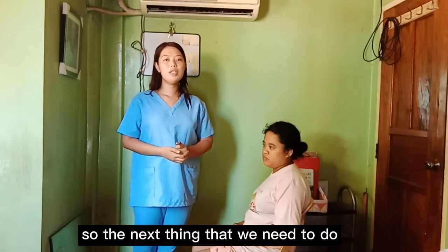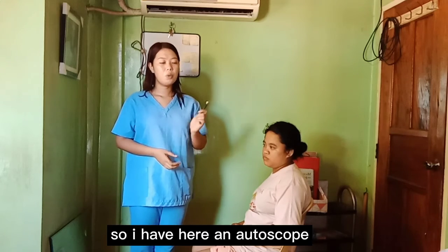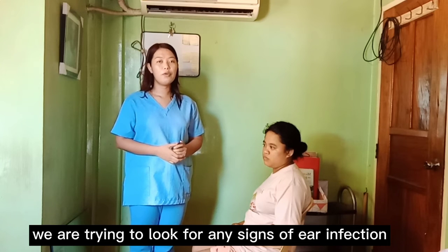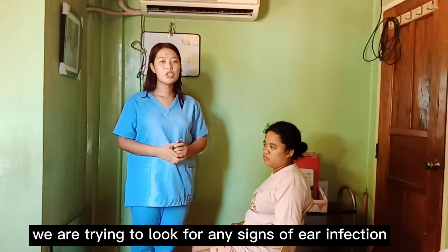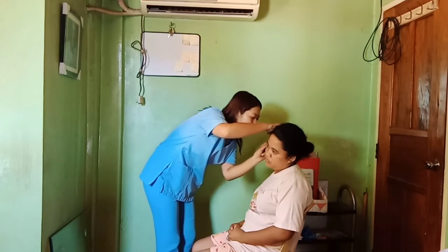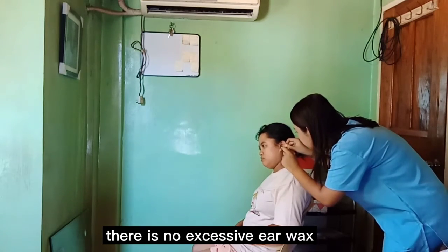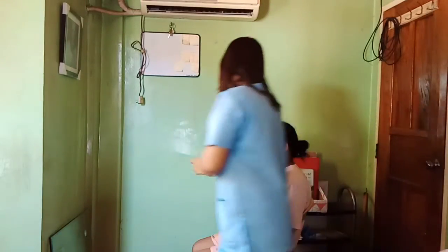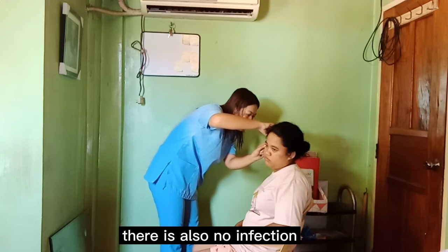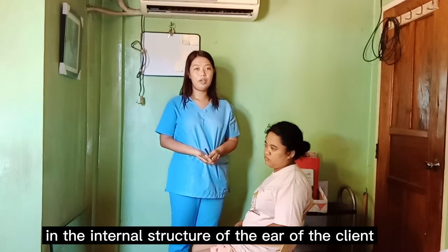So the next thing that we need to do is to inspect the internal area of the patient using an otoscope. So I have here an otoscope. By doing this, we are trying to look for any signs of ear infection or excessive earwax. Alright, so as I was inspecting, there is no excessive earwax. There is also no infection, so everything is normal in the internal structure of the ear of the client.